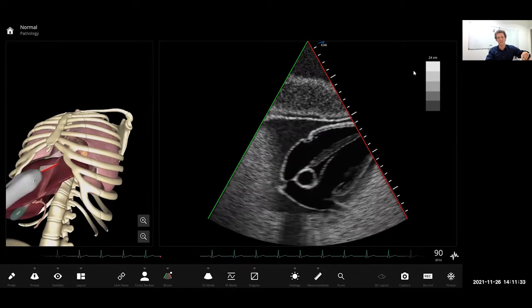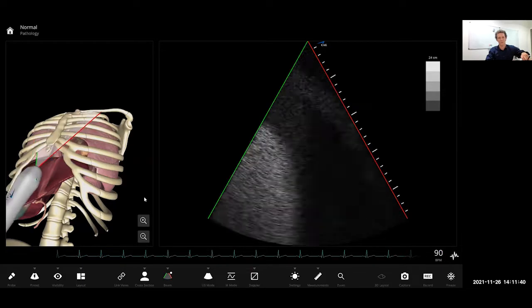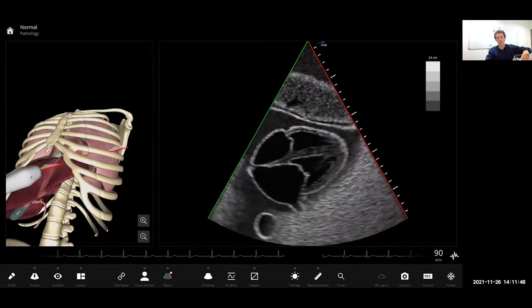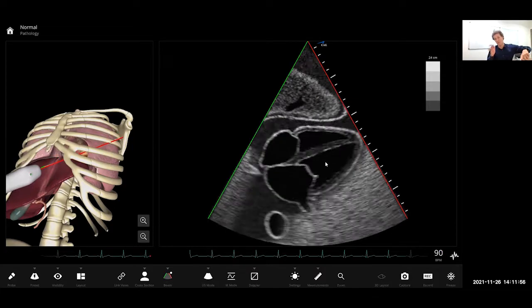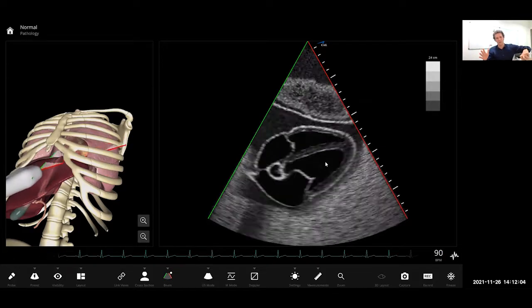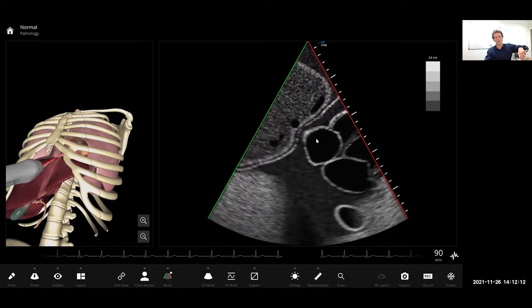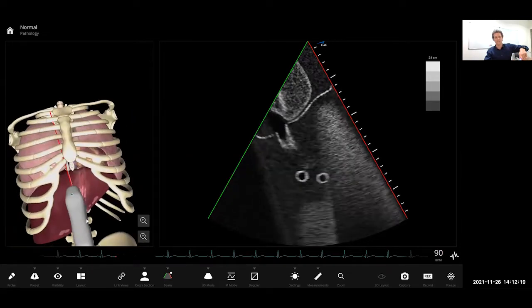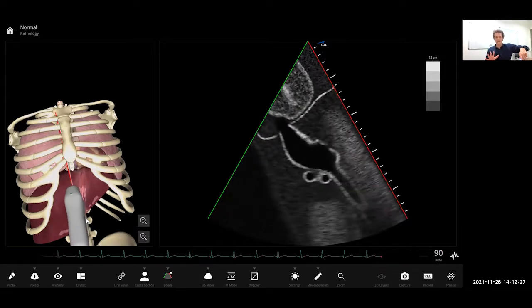We also often don't rotate enough to make the LV look as long as possible. The movements I'll do in summary: once I put the probe on, I start fanning down until I see something flapping — the heart — I continue to fan down until I lose that aortic valve, put the heart in the middle of the screen, and then rotate. Same rules apply as with basic echo: do one movement at a time otherwise you can get confused. Then I go and find where the IVC enters, put that in the middle, rotate, and find the IVC in the cranio-caudal view.